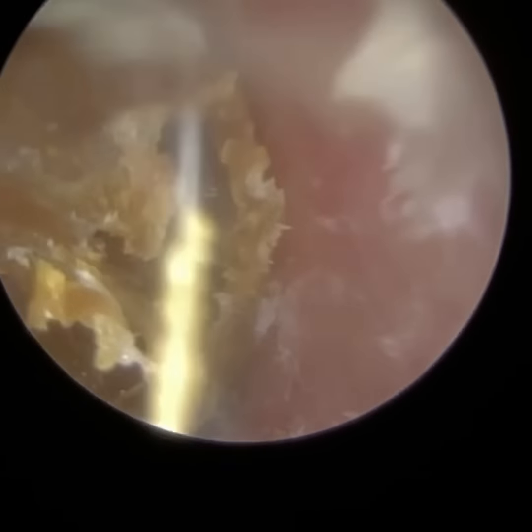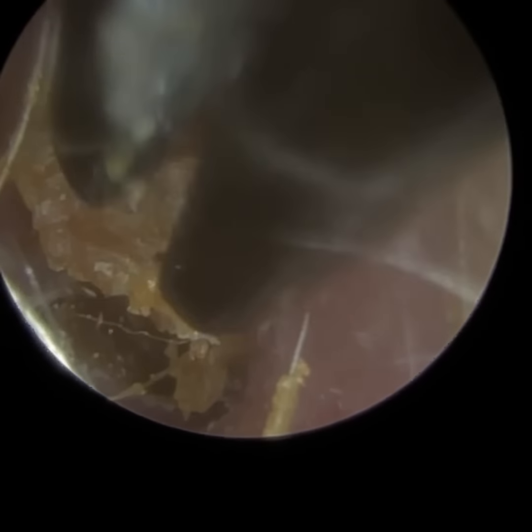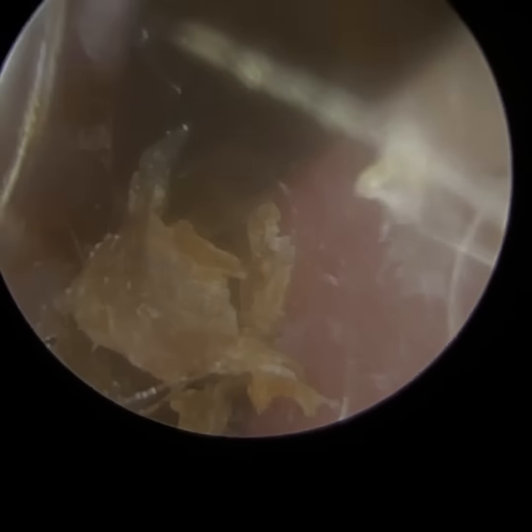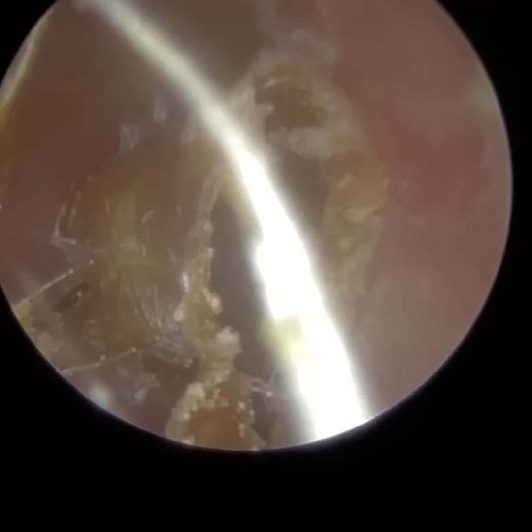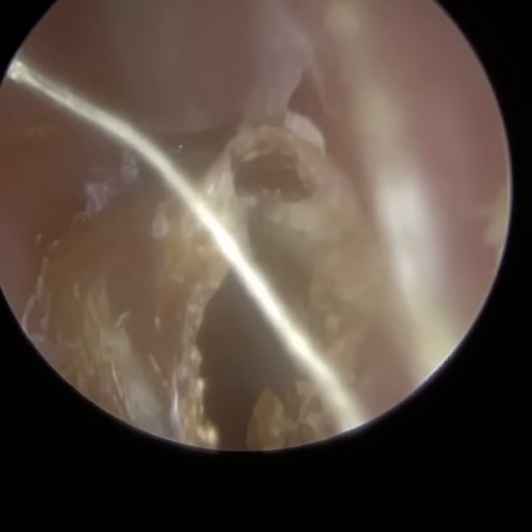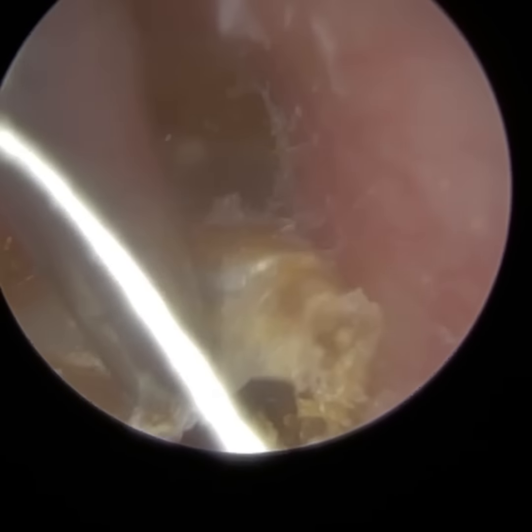Now, all this I'm removing here, it's not earwax, it's dead keratin. So the ear canal and the outermost membrane, so the lateral membrane of the eardrum, is lined with a layer of skin. So it's an epithelial layer of skin. It's the outer part of the skin.